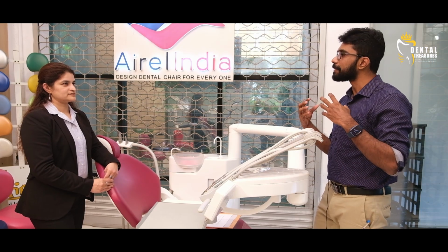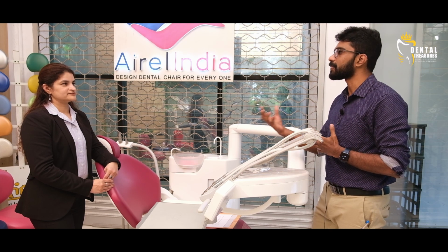So doctor, what is the most important feature a dentist should consider while choosing a dental chair? Most important feature a dentist should consider is basically they should have the comfort, the design, and the ergonomics. Ergonomics is very important for a dentist while choosing the dental unit because it is related to the dentist's health and hygiene. So when the dentist is using a dental unit, he should be very comfortable so that it doesn't affect their back pain, neck pain, and strain their eyes. That is the basic areas where a dentist generally gets affected, and stress and strain which causes the back pain, the neck pain, and the stress to the eye and damages these particular areas of the body.